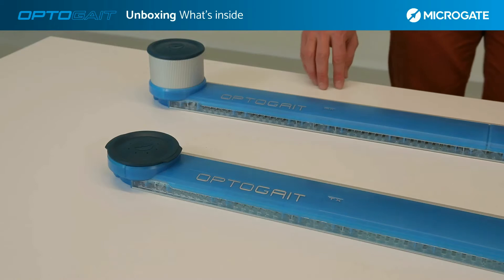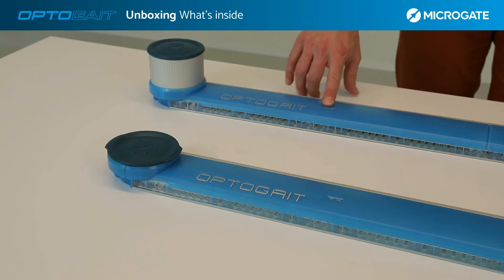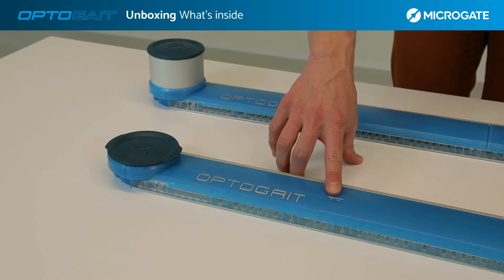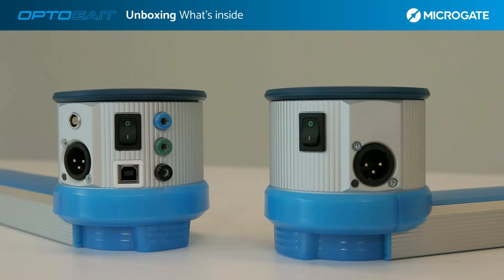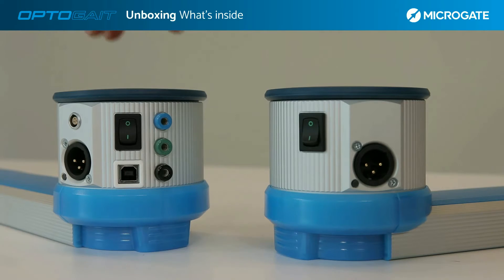In the single meter kit we find the two bars, respectively a receiving bar and a transmitting bar. Both bars connected at the same time have two small towers that house an interface inside them, which represents the central unit that we will see in detail later.